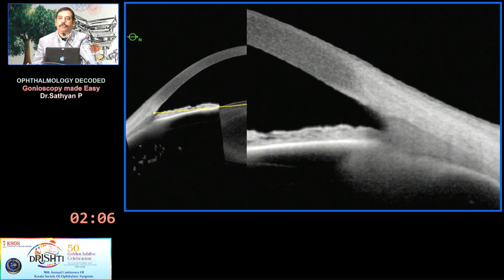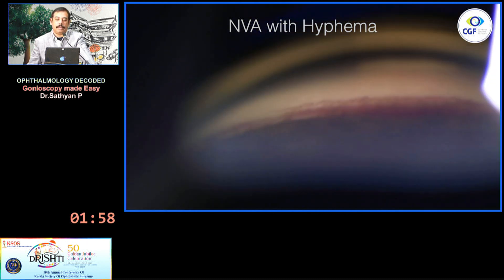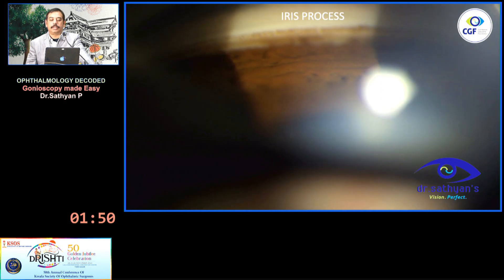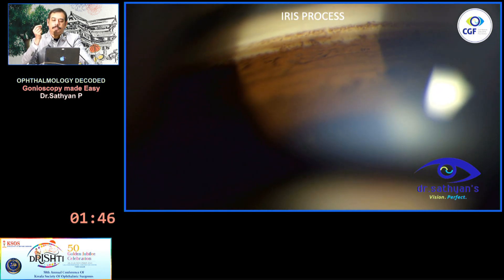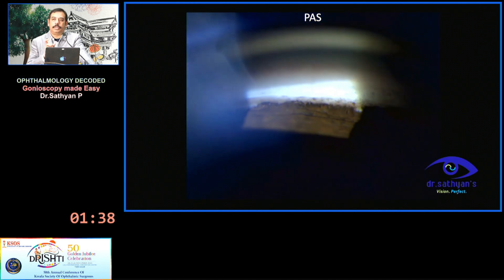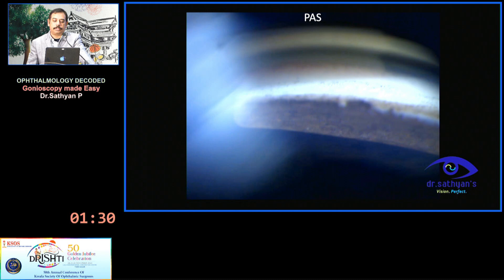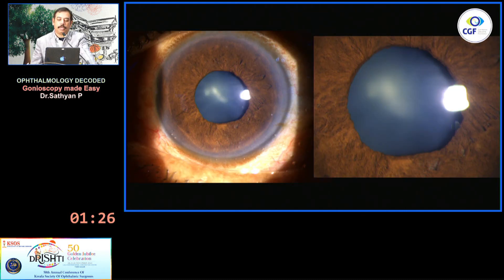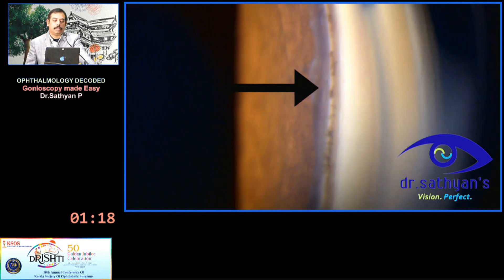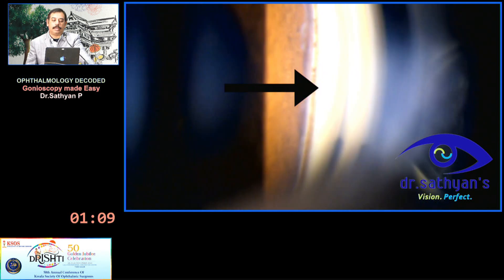Over the scleral spur you can see blood, NVA, and the angle with a little hyphema. Then, regarding iris and ciliary body — understand iris processes: these are filiform, vessel-like, brownish patterns that do not obstruct aqueous outflow. Peripheral anterior synechiae (PAS) are broader and do obstruct outflow. These are the two main things to differentiate. In traumatic dialysis you can see how wide the ciliary body band is — a dark grayish, large band. This is typical of angle recession glaucoma.